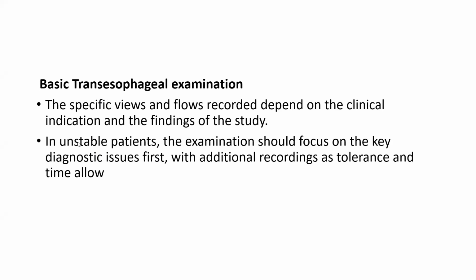First, because sometimes the patient will be unstable, for example, become hypoxic or hypotensive or not cooperative. If you give him sedation, of course, he will become cooperative, but sometimes you cannot give it. Sometimes the patient pulls the probe. So first, the examination should focus on the key diagnostic issue, and then additional views you obtain later.